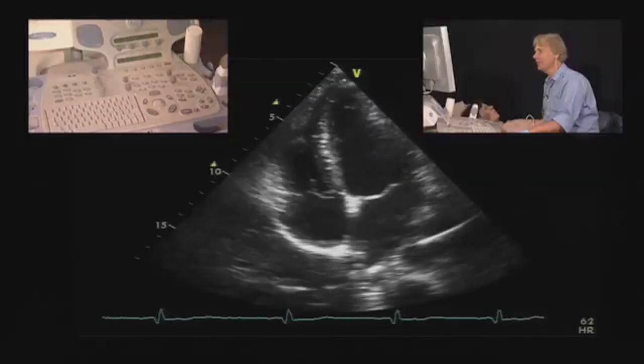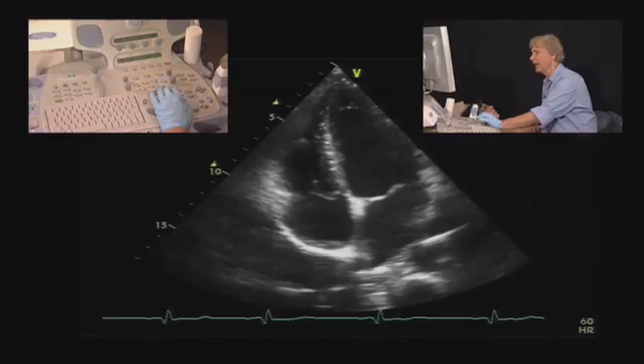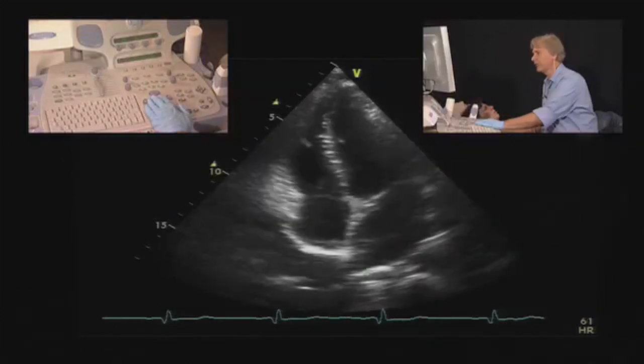Now let's turn to the pulmonic veins, and let's see how we can actually record a signal there, and then let's discuss where it is useful. First of all, you need a 4-chamber view, and you have to visualize the pulmonic veins, especially the right upper pulmonic vein, which is this structure here.